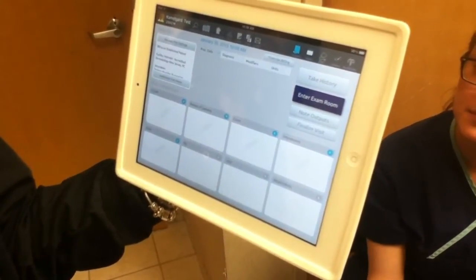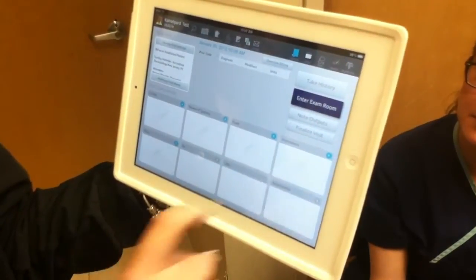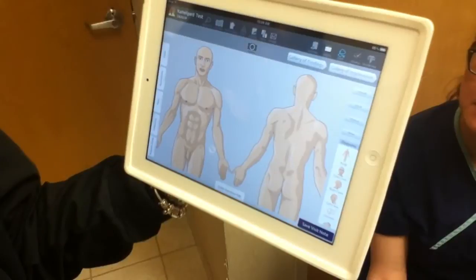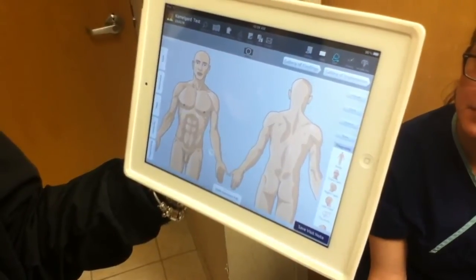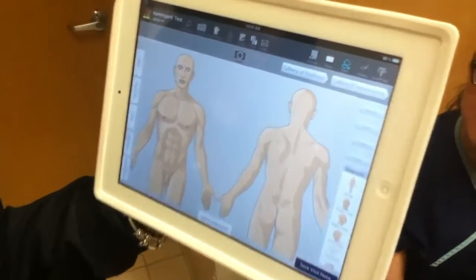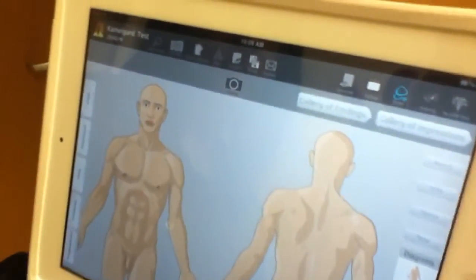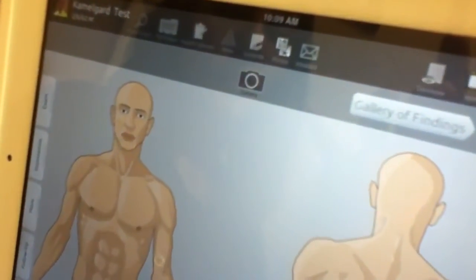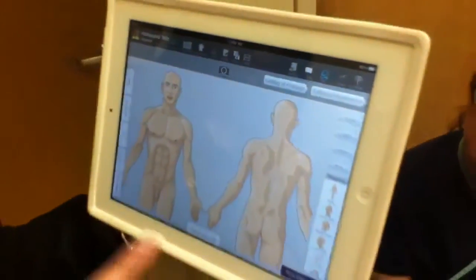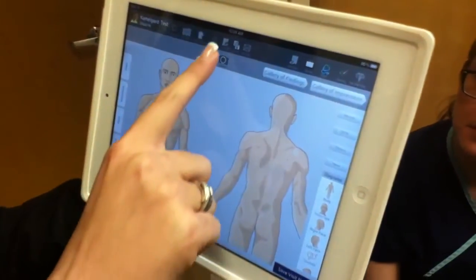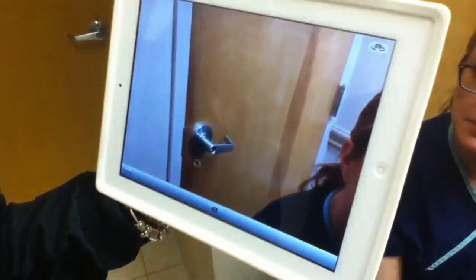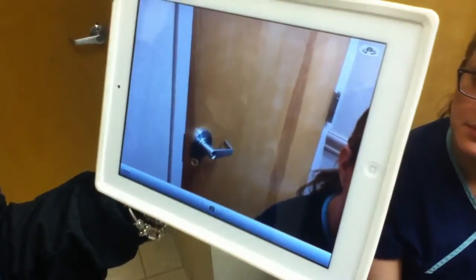Now you're at the familiar visit home screen. We're going to jump straight to going into the exam room by pressing the Enter Exam Room button. The familiar screen comes up with the body picker. Notice at the top of the window where the body picker is located is an icon that looks like a camera and says 'camera.' Caitlin is going to touch the icon, and it's going to open up a shutter, which now gives her a camera.